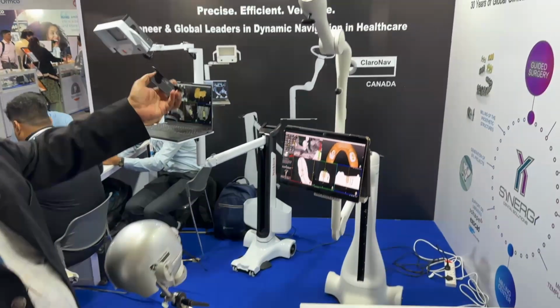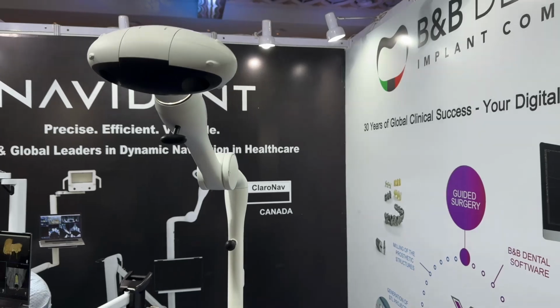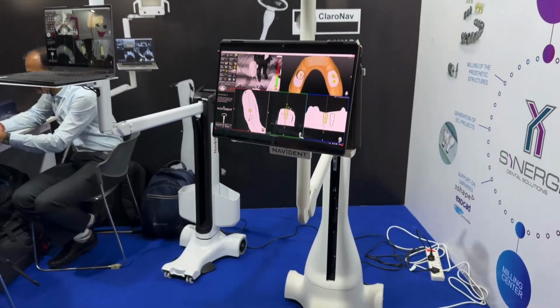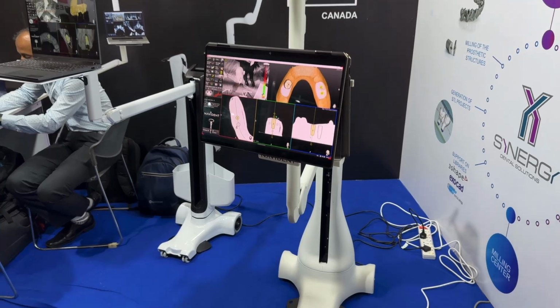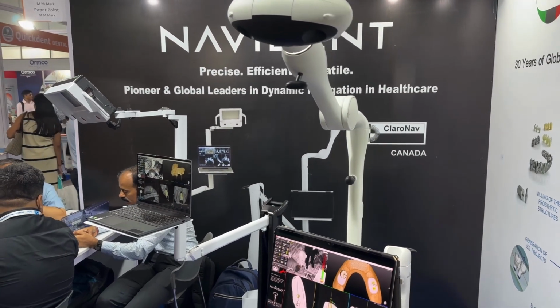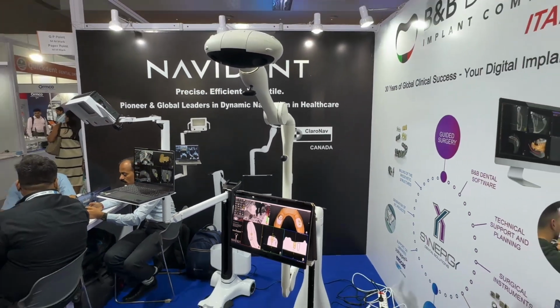Here you see a camera. This is a system called the Navident system, a device used for dentistry. The cameras are used in multiple industries in healthcare, in spine, cranial, ENT, orthopedic and others. Right now we are going to talk about Navident in dentistry.